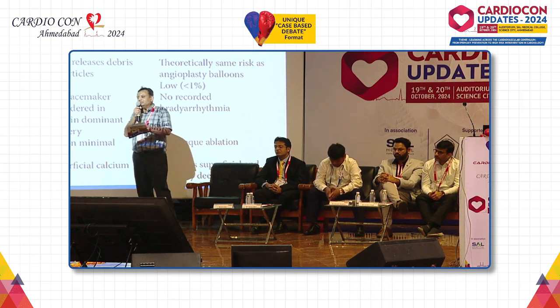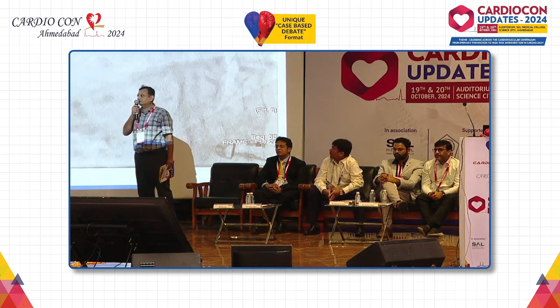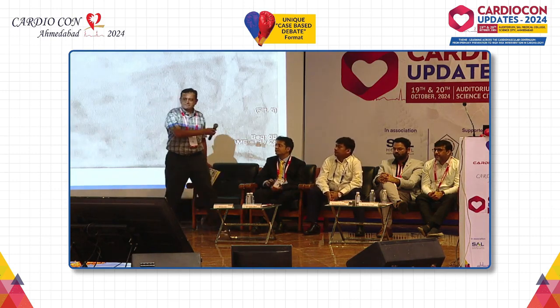So in this patient, I think we should try to use intravascular imaging first and then decide. If we can pass the IVL, IVL is good. Otherwise, we can decide on orbital or rotational atherectomy. Thank you. Any other comments?